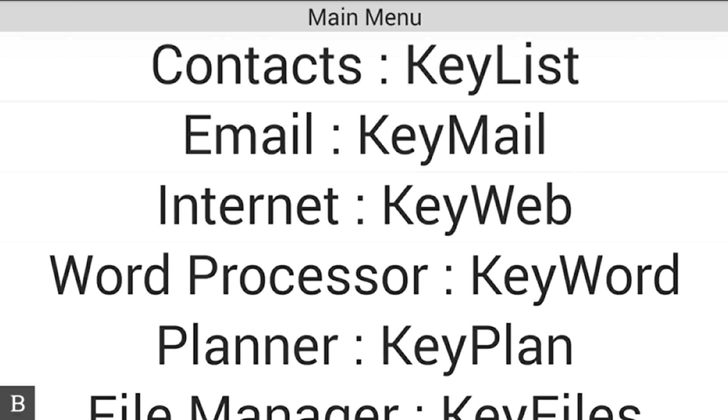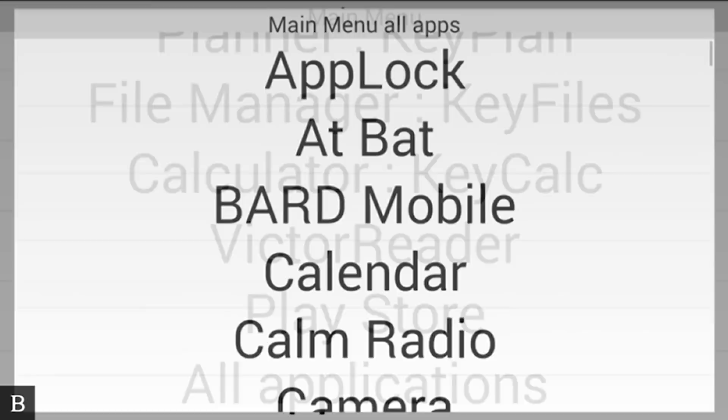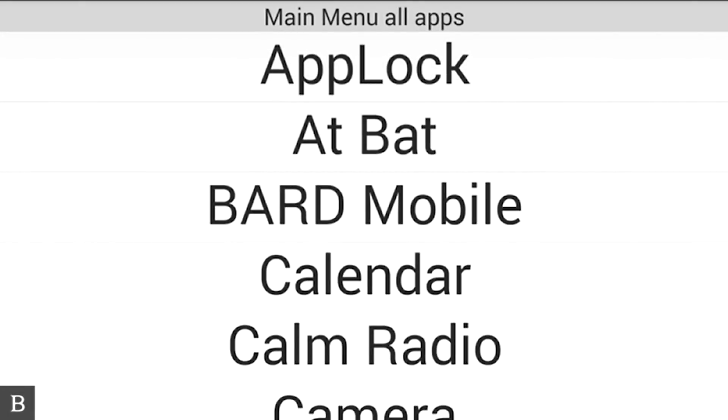I'm going to hit A for all applications from the main menu. I'll press enter. Now we're on the main menu all apps. This is a list of every application that's been downloaded on my BrailleNote Touch.